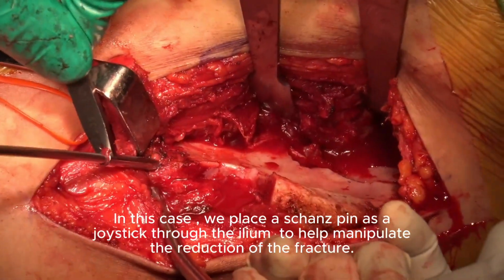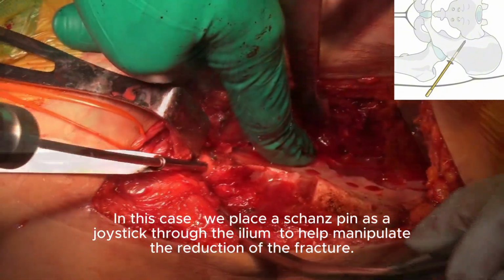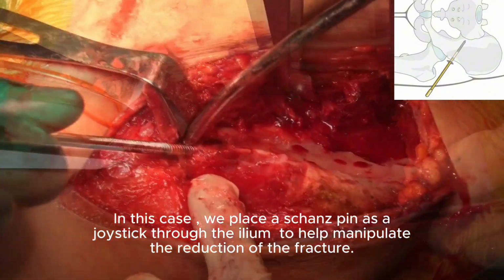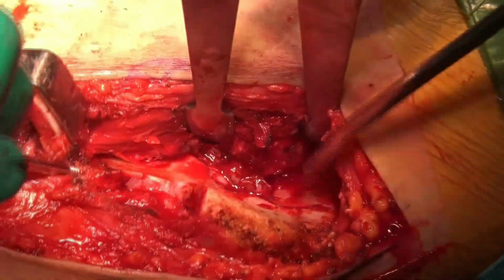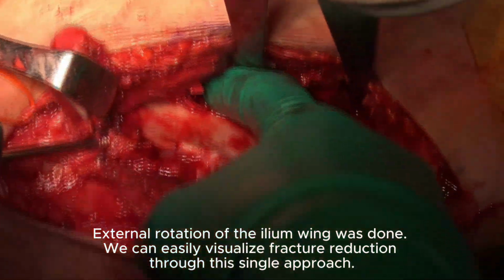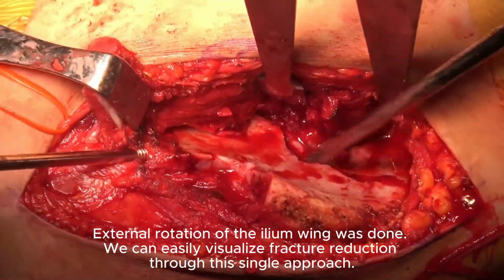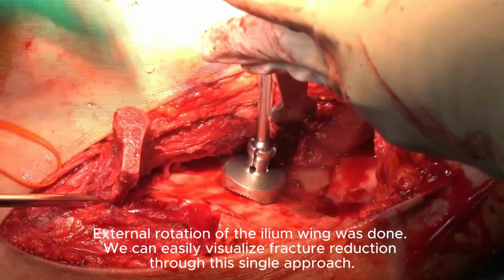In this case, we place a Schanz pin as a joystick through the ilium to help manipulate the reduction of the fracture. External rotation of the ilium wing was done. We can easily visualize fracture reduction through this single approach.